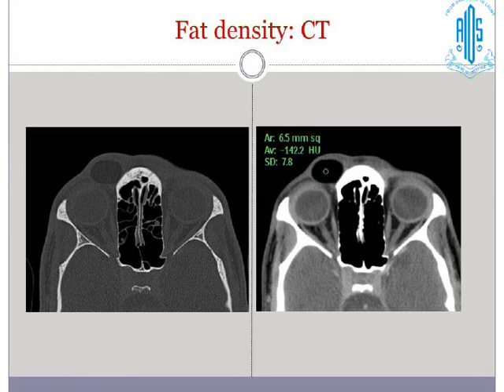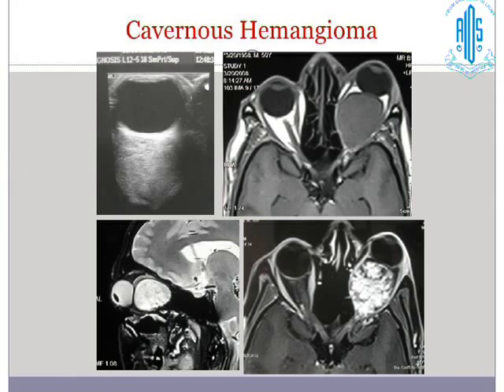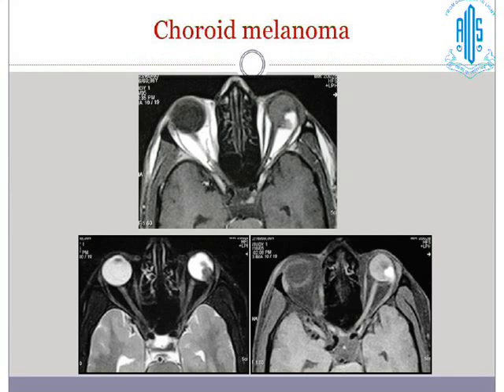Ultrasound in this patient showed what could be a tumor behind the globe, but we are not sure how far back, and you cannot define it that well. So MR comes in handy. In a typical middle-aged group, you see that there is expansion of the intraconal space with a large space occupying lesion causing proptosis. The optic nerve can be easily seen to be separate from this mass, displaced anteriorly, and post-contrast you see a patchy enhancement which later became homogeneous. Diagnostic of cavernous hemangioma.